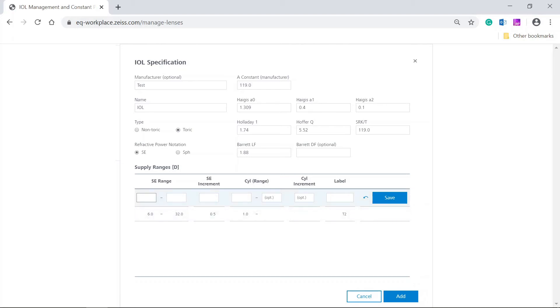Again, enter the SE range for the second delivery range, for example, plus 6 to plus 32. Enter the SE increment accordingly, for example, plus 0.5 diopters.